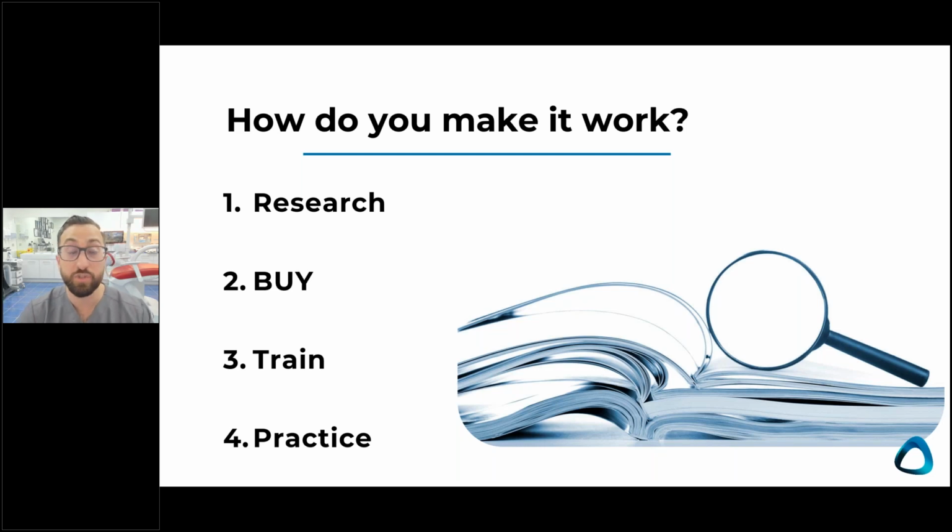The next thing you need to do is train, appreciate, and accept the fact that you're not going to be able to just use a scanner proficiently on day one. It's going to take some training. It's going to take some practice. And that's just part of the game. Everyone goes through that learning curve. And how you get better is just practice, practice, practice. When you buy a scanner, scan your DA, scan your reception staff, scan your wife, your husband, whoever. You need to practice. Don't just jump into a patient's mouth with some technology that you've never trained or practiced and then end up in a frustrating clinical situation.